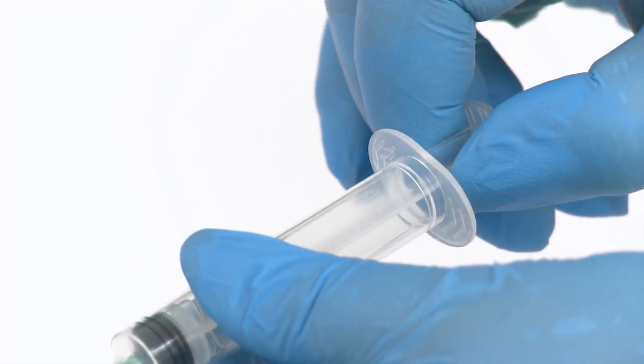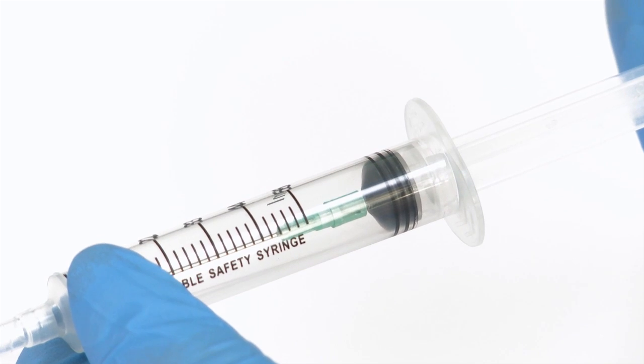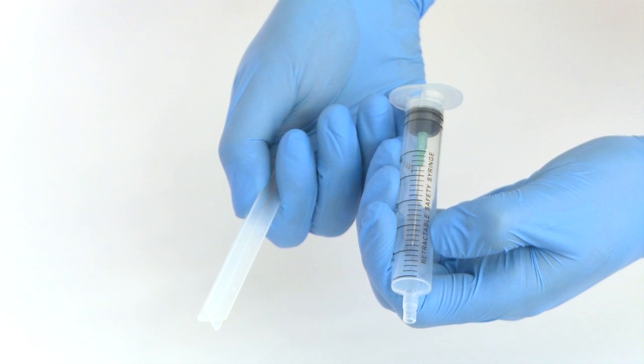After the needle is withdrawn from the patient's body, withdraw the plunger until it reaches the end of the barrel and locks into place. Snap the end of the plunger, housing the needle entirely within the barrel of the syringe.